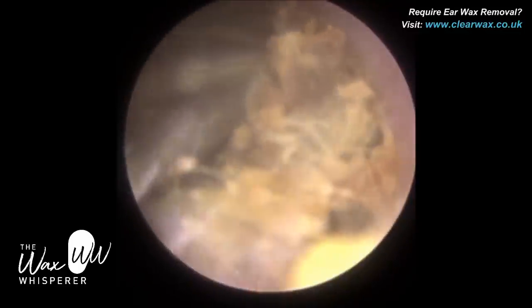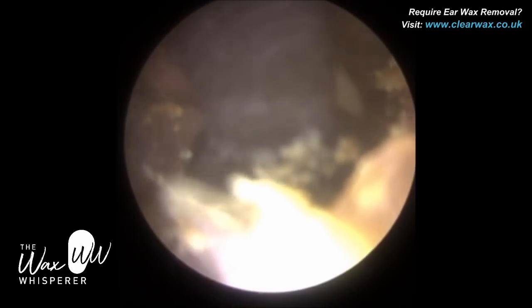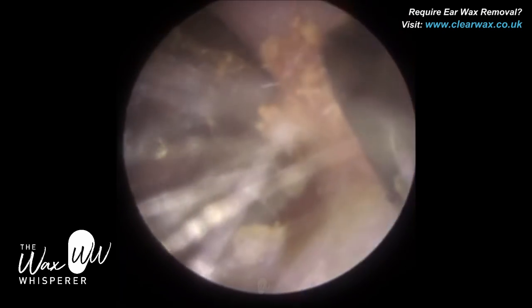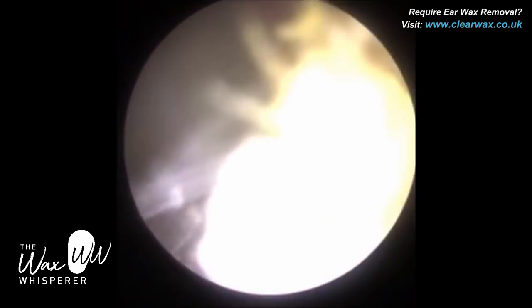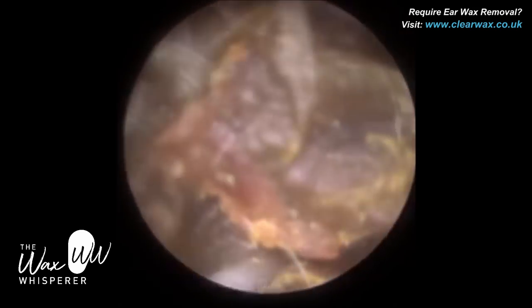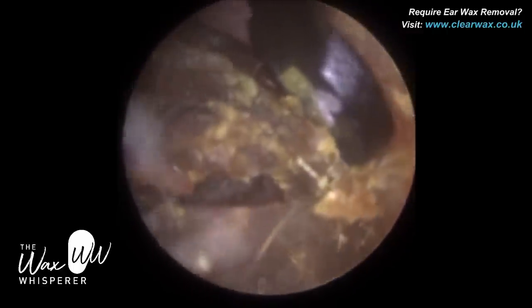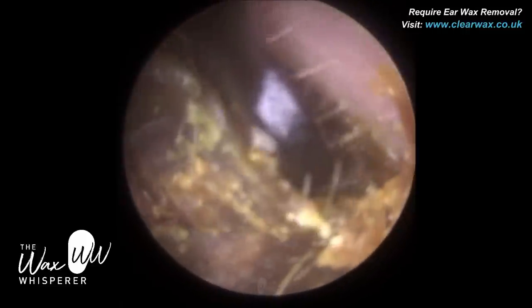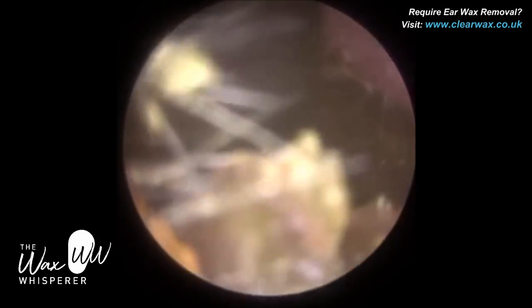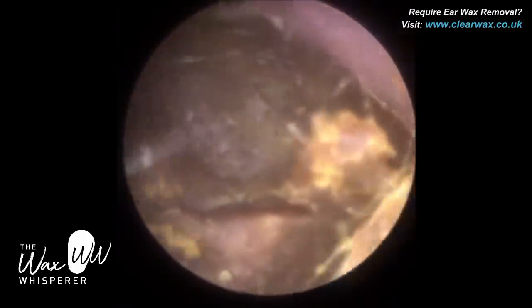So I'm now using a jobson horn curette, and I'm just digging into it. The head of the curette is almost like a hollow spoon, angled forwards about 30 degrees. I angled the tip into the wax and slowly brought the curette forwards. You have to be very careful, because when you bring the jobson horn forwards — or an ear hook for that matter — it's very easy to dig into the base of the ear canal and scratch it, cut it, make it bleed. That has happened to me before. So you've got to be very careful when you manipulate these instruments.